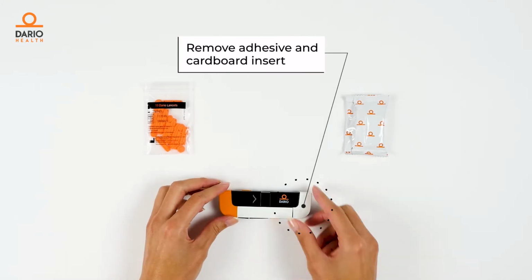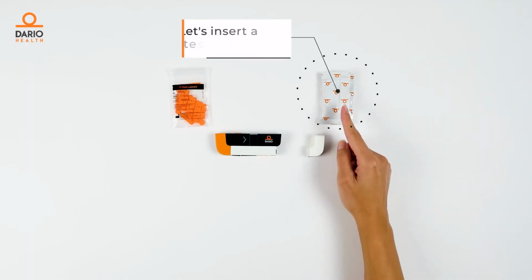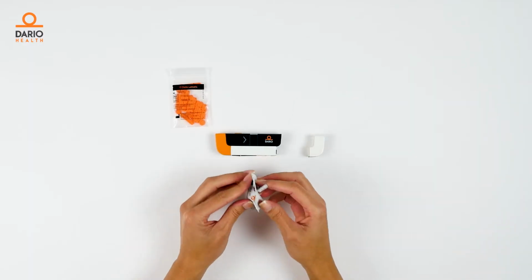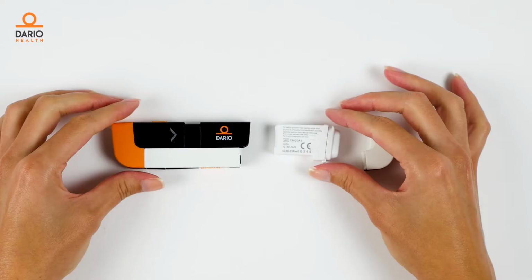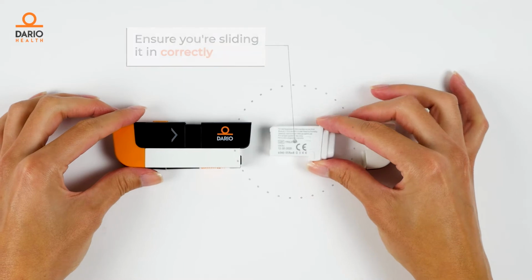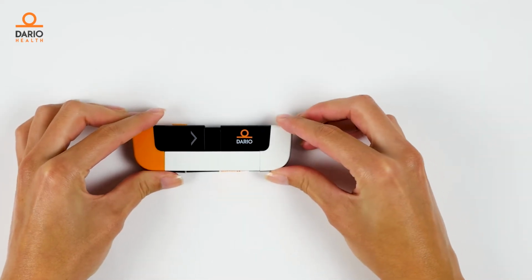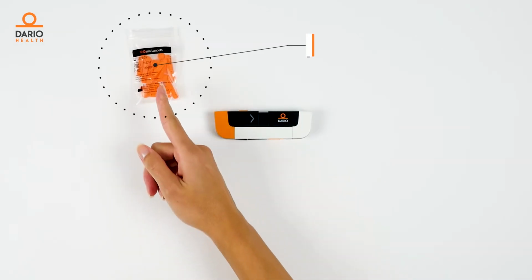To get started, remove the adhesive strip and open the white cartridge cover. Remove the cardboard insert. Open the foil test strip package and remove the test strip cartridge. Insert the cartridge into the cartridge holder with the test strip cap facing outwards. Snap the cartridge cover back on.